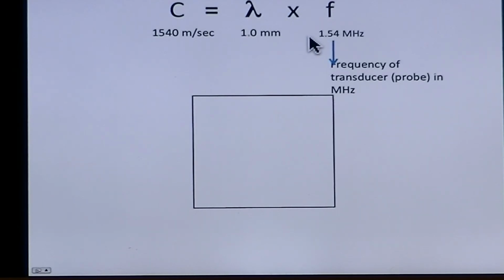Now in the early 70s, that's when diagnostic ultrasound really came to fruition. This is the area that we were looking at in frequency, and therefore that was the problem, because we had 1 millimeter dots that we could not really see whether it was a boy or girl or not unless you had a lot of experience. And so this is really inadequate for any diagnostic resolution at this point.